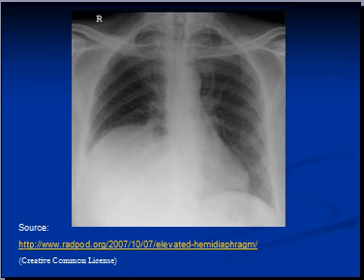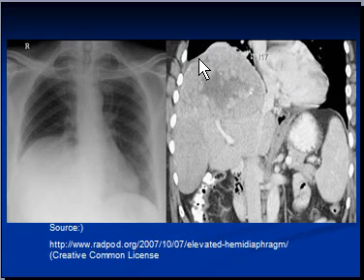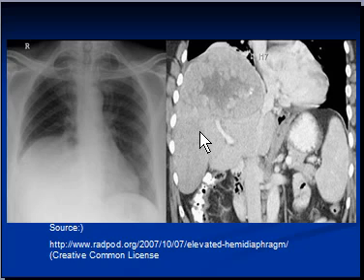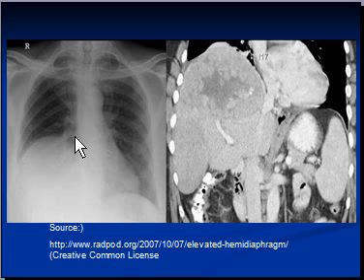A large liver, for any reason, can push the diaphragm up, as was the case with this patient. This patient had a CT scan of the abdomen, which is here on your right-hand side. You can see a big encapsulated mass in the liver. This part of the liver is also not normal. The mass is big enough to push the diaphragm up. This is the right hemi-diaphragm, which is visible here, and this is the left hemi-diaphragm, which is visible here.